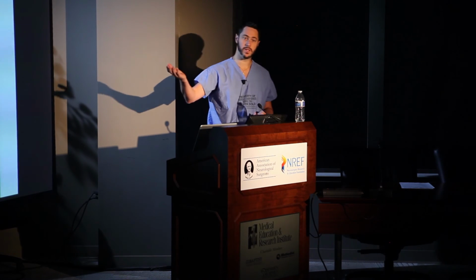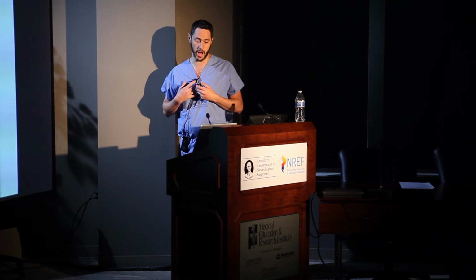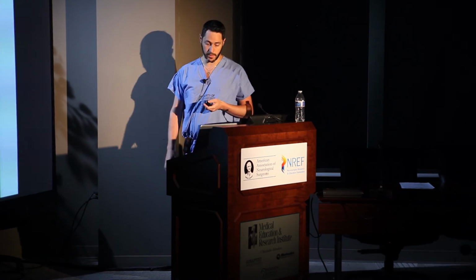Stop. And what you need to do is fill up that pedicle. So watch right there. It's going to get fatter in a second. Fatter, fatter, fatter, fatter. Injecting faster. And this was an error on my part. This was high flow and it was only 60%. So I had to inject faster to slow it down. Or coil. But again, this is so deep that the only microcatheter we get there is a Marathon. At least, maybe other folks can get bigger coiling catheters there, but I wasn't able to, and didn't plan to.